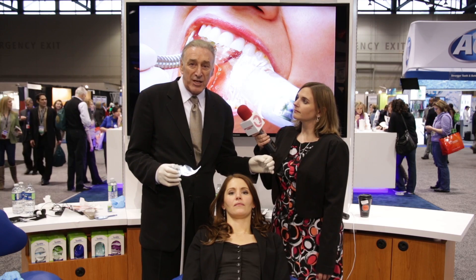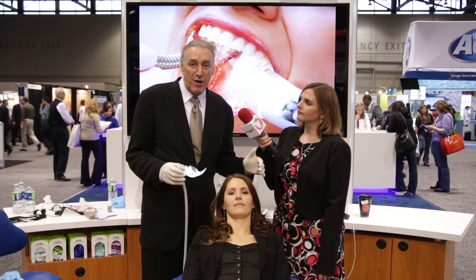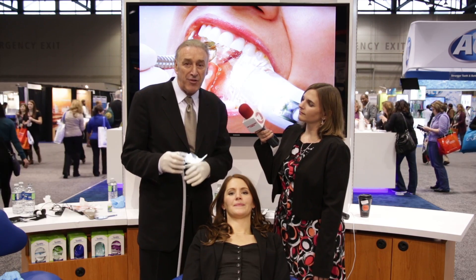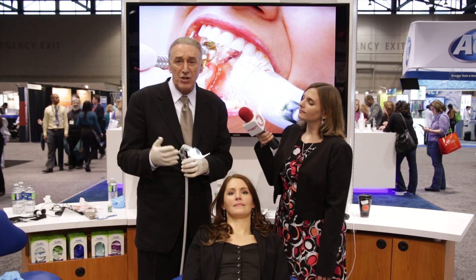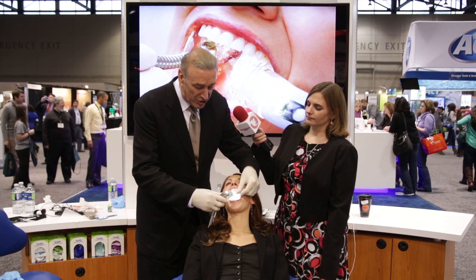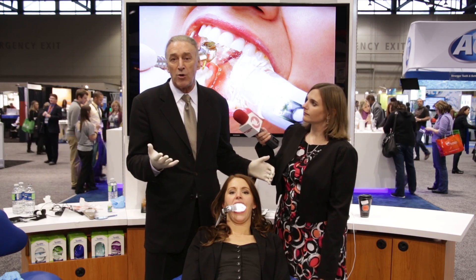I want to control the tongue, the cheek, the throat. I want to make sure that my patient is comfortable and that everything that we do on the patient is done in a very safe and predictable fashion. What makes me different is I found this quick and reliable way to isolate the mouth with the Isolite mouthpieces. We have five different sizes of mouthpieces, so there's no need to take out a mouthpiece and trim it, which is really nice. I take out the mouthpiece, I put the mouthpiece on, I insert it in her mouth, and in about three seconds I've got great visibility and great control of the oral environment.